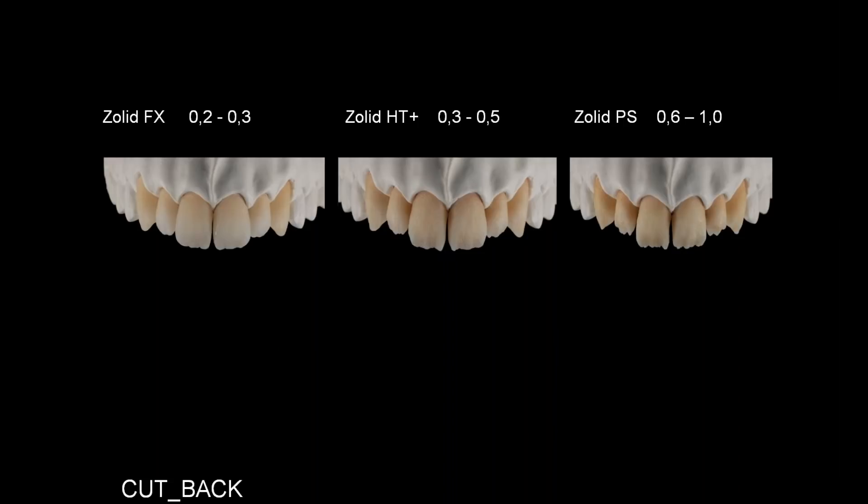Now we're going to talk about cutbacks. As you can see, we are back to the basic division. For Solid FX, we make a minimal cutback of 0.2 to 0.3 millimeters. The cutback is that small because we want to use the maximum of FX — that is its translucency. We leave this bit of space for individualization with ceramics if you have a complex color. For Zolid HT+, we have a cutback of 0.3 to 0.5 millimeters. HT+ is the middle ground of strength and translucency, but it's not as translucent as FX, so we make a bigger cutback.